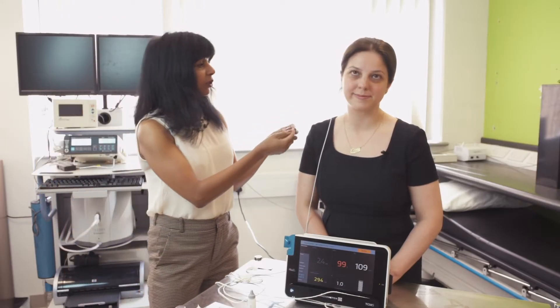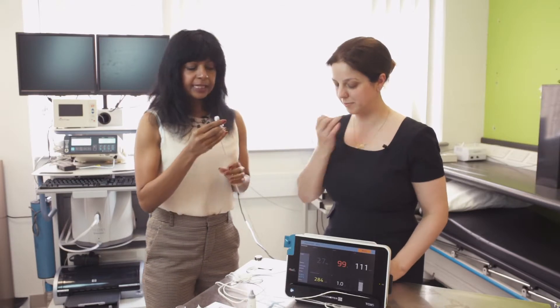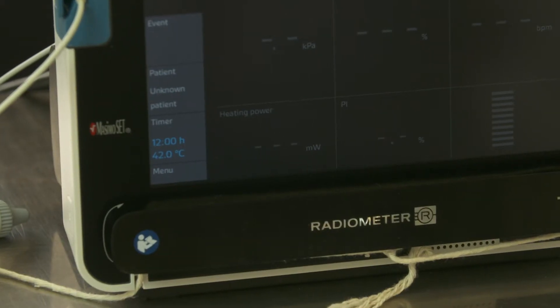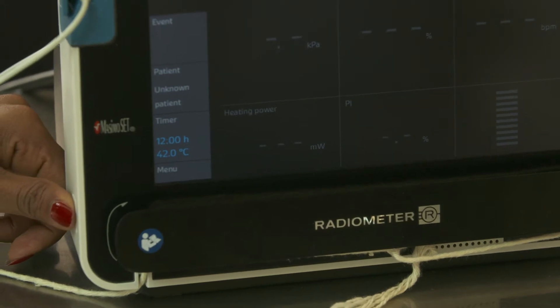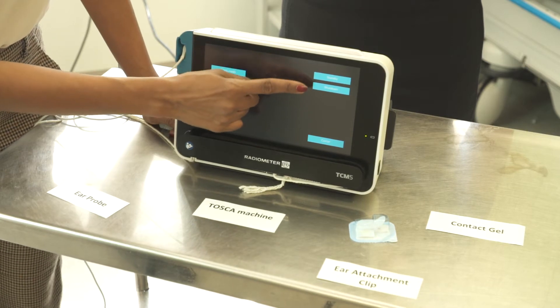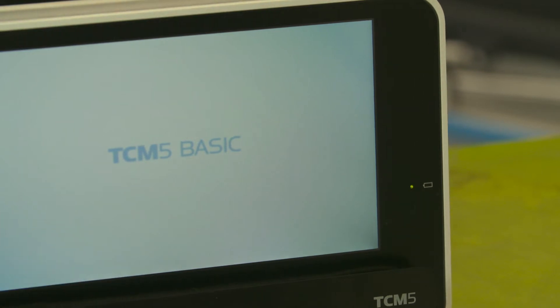In the morning, when you wake up, you just need to remove the electrode and replace it into the machine. You can now remove the ear clip. We're now going to turn the machine off — press the on-off button for about one second, and it will display standby or shutdown. Tap the screen for shutdown, and the machine will shut down.